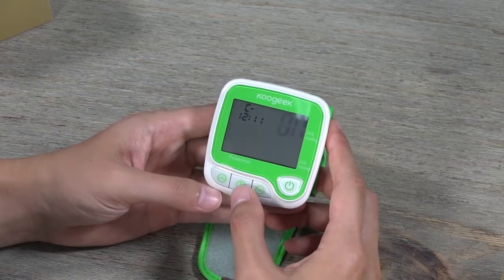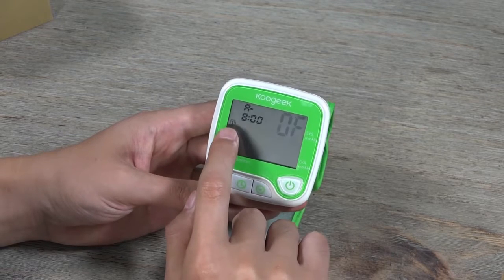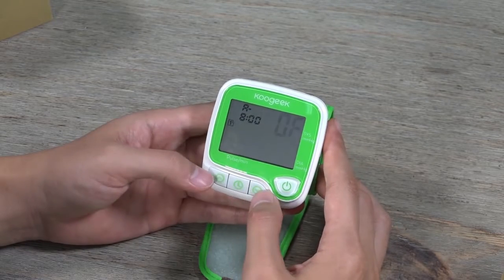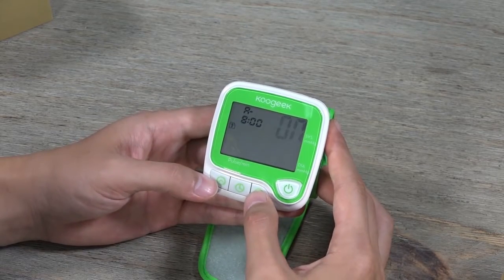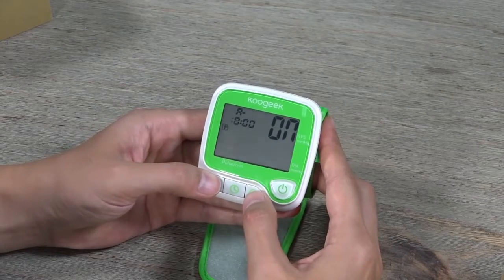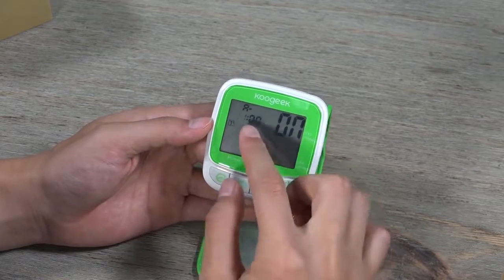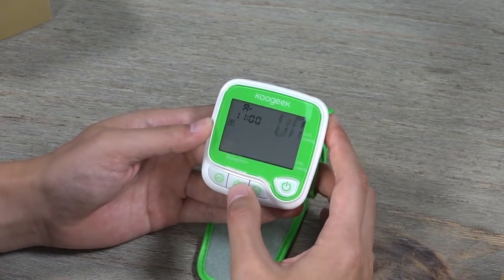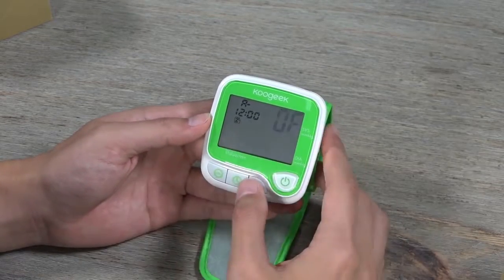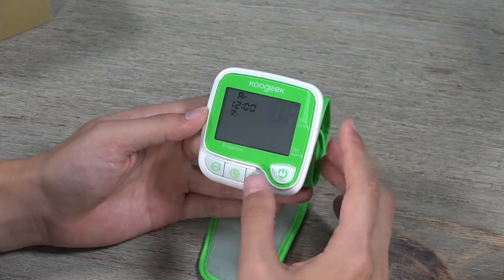If you turn the alarm on and press confirm, you activate the alarm function. This is the first set of alarm — you can activate more. You can change the time; for example, setting it to 11 o'clock to remind you to take your blood pressure at 11. There are multiple alarms you can set to remind you to take regular measurements.